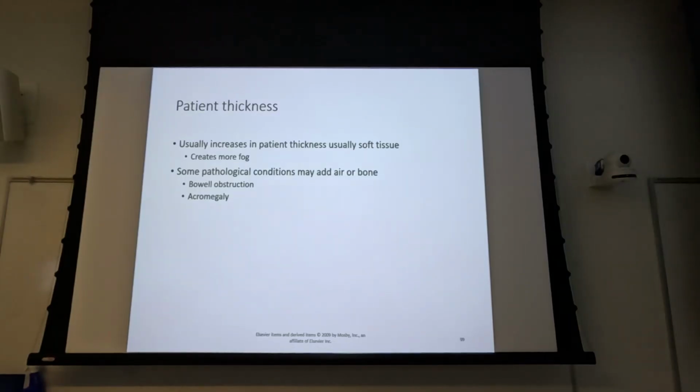Really, you should be checking the chart, right? You should know why you're taking the x-ray. That's the first thing. But after that, those are your telltale indicators. Well, you can't find the chart, whatever. Ask the nurse. If you can't find a nurse, then you've got to start to do a little triage.